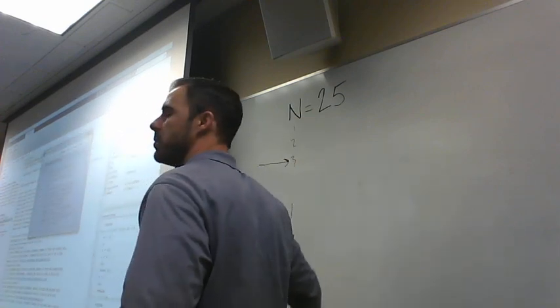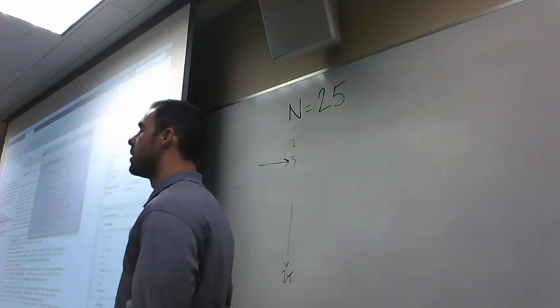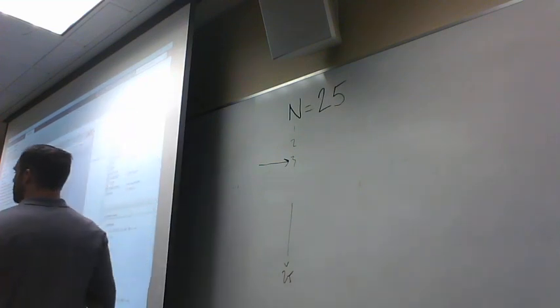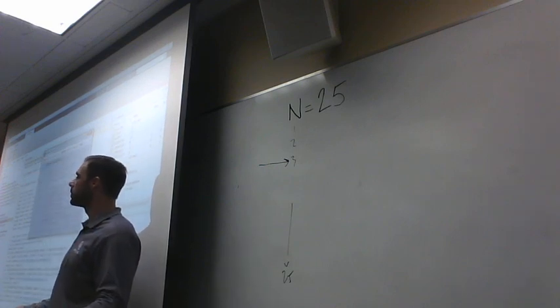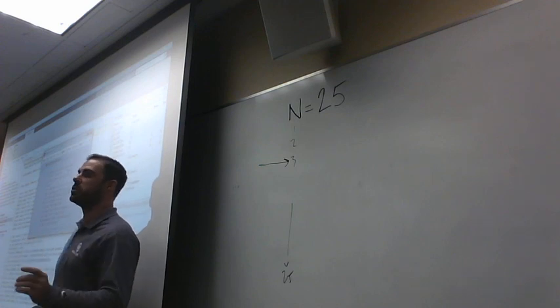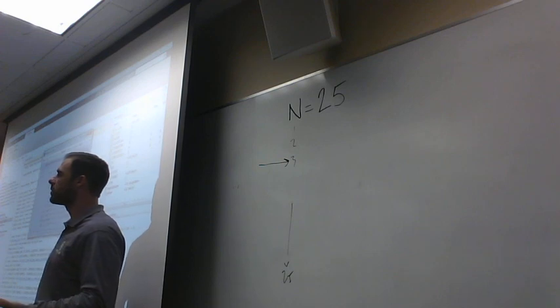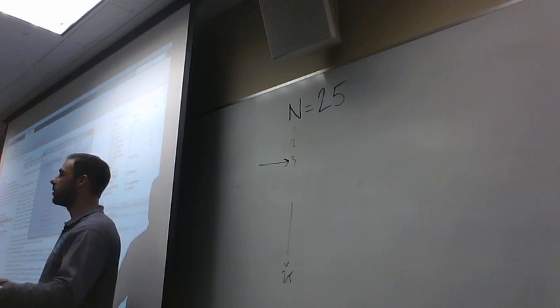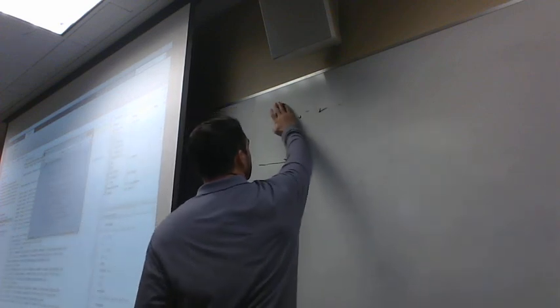We have 25 subjects as opposed to just 1 or 2. That's really helpful for a handful of reasons. We're going to talk a lot about this idea that we call signal to noise. So what is our signal here? The ERP? Not the ERP yet. The signal is EEG. So what's the difference between EEG and an ERP? Yes, ERP is an averaged electrical potential. We can talk about that here.